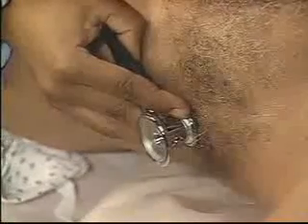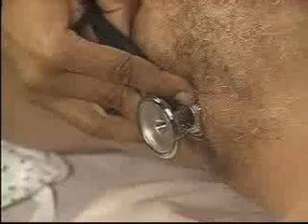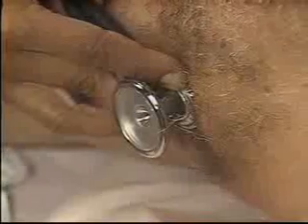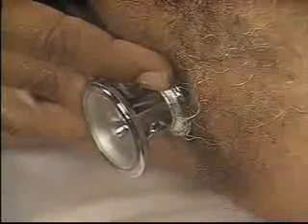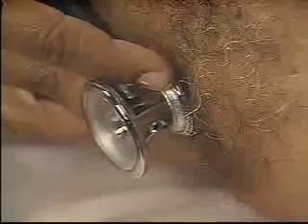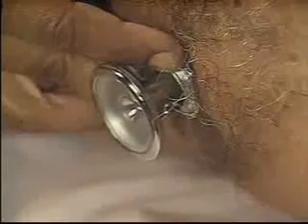If the patient had an audible S3, it would sound like this. Notice how the third heart sound disappears when the bell is placed more firmly on the chest wall. Listen again with light pressure, then with firm pressure, and once again with light pressure.